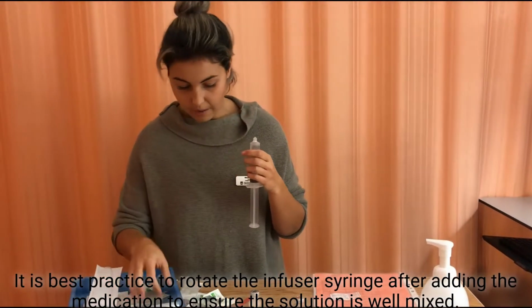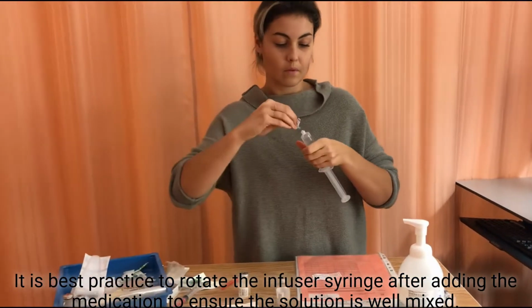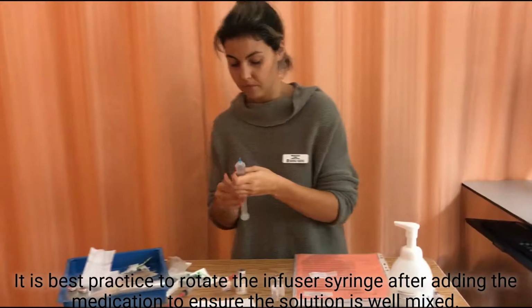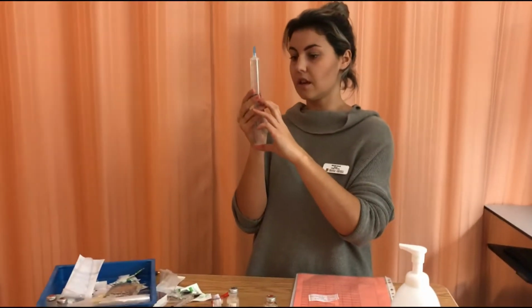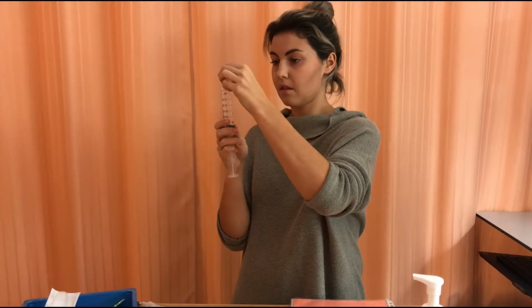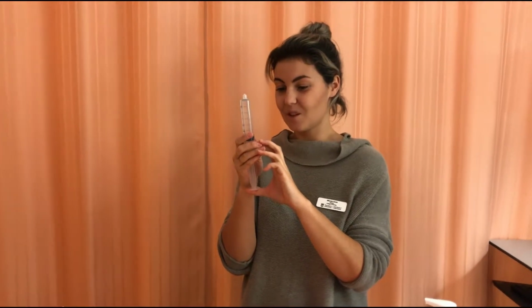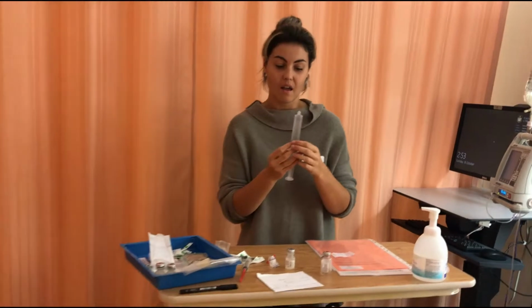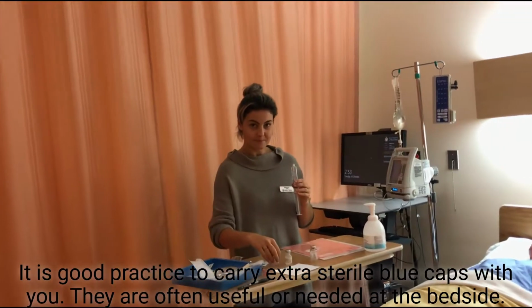Place my blue cap on. Make sure there's no bubbles and ensure that it is a volume of 30 mLs. So I just lost my blue cap. In this instance, I would use the call bell to have a nurse grab me another one.